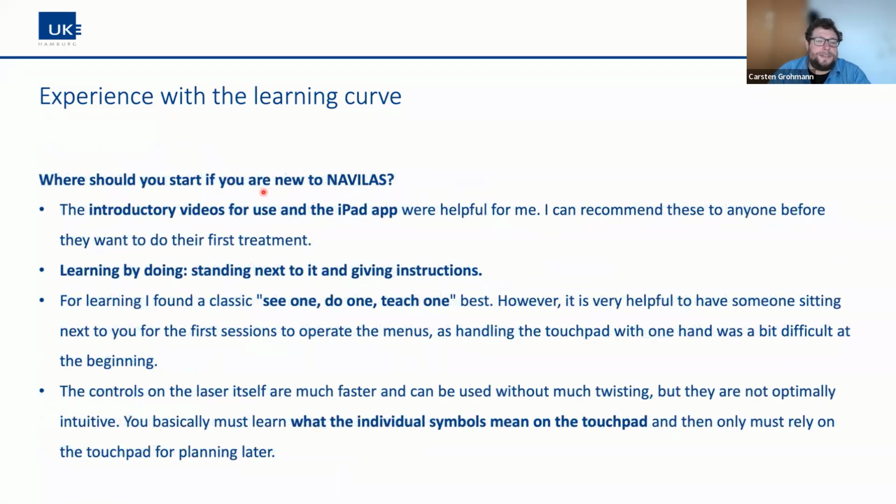Where should you start if you are new to Navilas? Good question. Introductory videos to use from the iPad app were very helpful for me. As I explained at the beginning of this session, we had 2 approaches. The first one was to have a look at the expert library on the Navilas homepage to see the videos and the different instructions, and then trying to doodle yourself with the iPad app, the Navigate app, to get familiar with the system and the approach on the laser. I can recommend this before the first treatment. I would do so also.